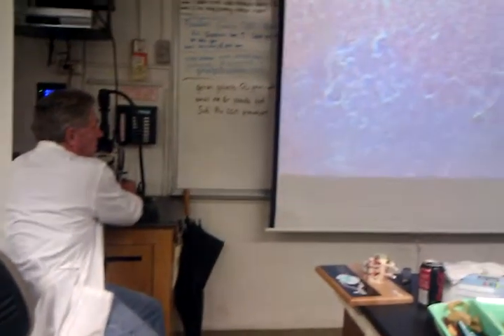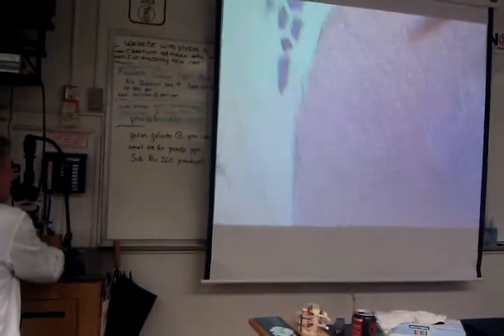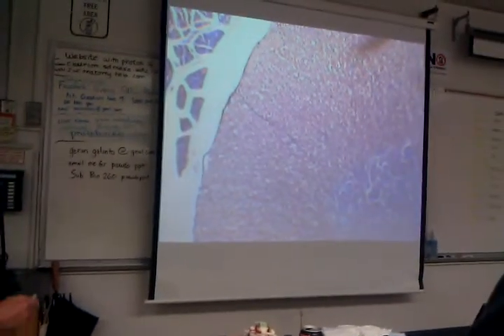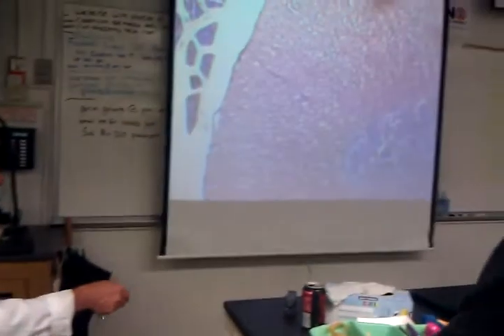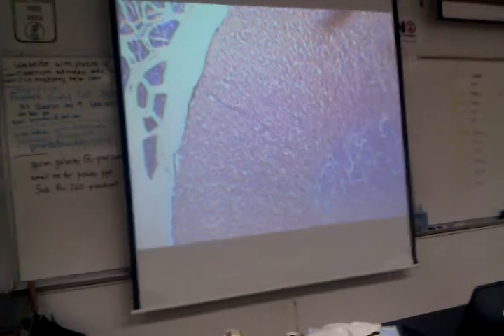But that's not. Can you go back to the motor neurons really quick? All these guys, and they're going to send their impulses out of the cord. See if there's anything left of it. It's really chopped up, but they're going to send their axons out of the cord this direction and out the ventral root. In other words, they're going to come out this direction. And so sensory in and motor out. Right? So their axons are going to leave. These are the cell bodies. They're in the central nervous system. They'll always be in the central nervous system. And they go out this direction, out the ventral root.